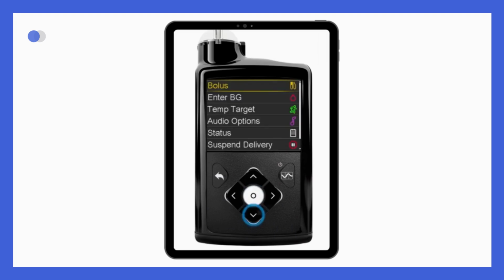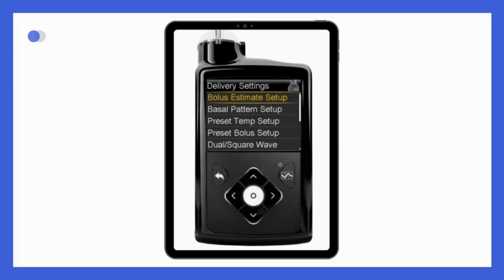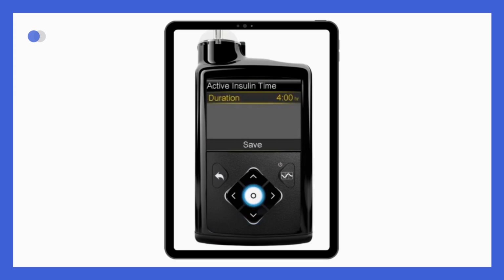The insulin pump's primary advantage is the precision and customization it offers. To make the most of it, you should adjust settings based on the observed patterns. You may also need to tweak these settings frequently, at least in the beginning, to achieve optimal glucose control.